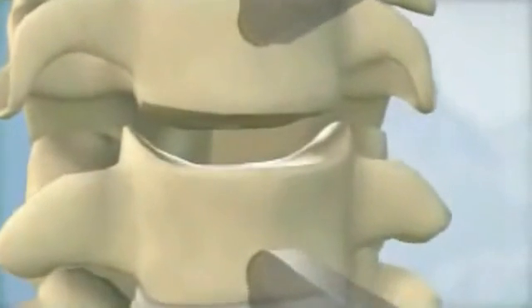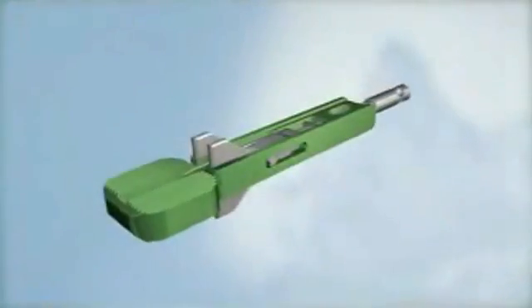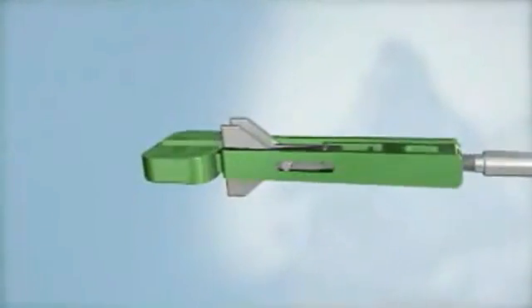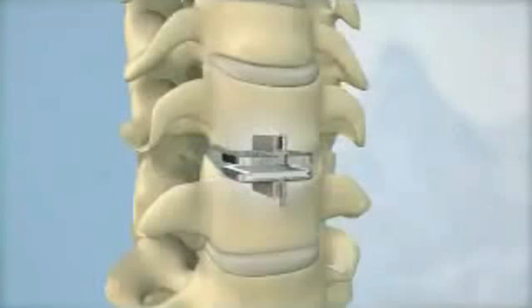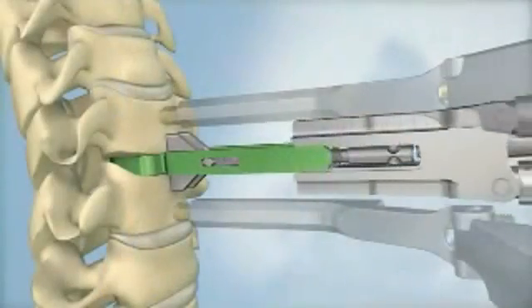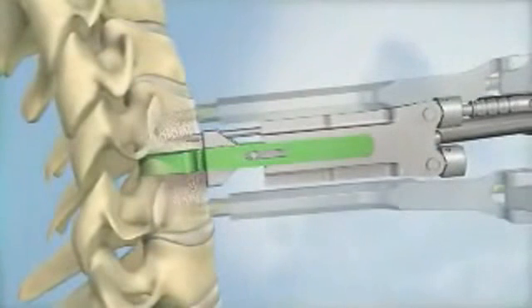Once the disc space is cleared and the segment is remobilized, a trial is used to assess the implant size and position within the disc space. Next, keel channels are prepared in the vertebral bodies above and below the disc space.